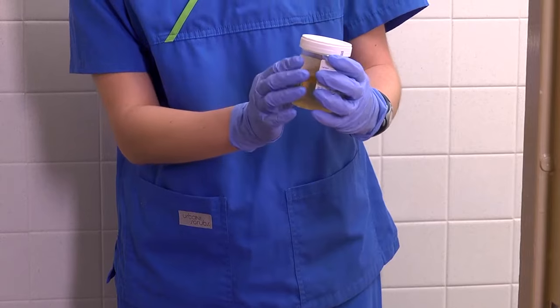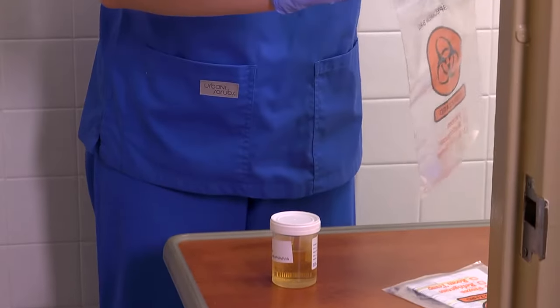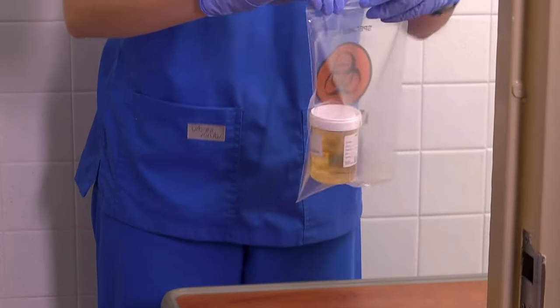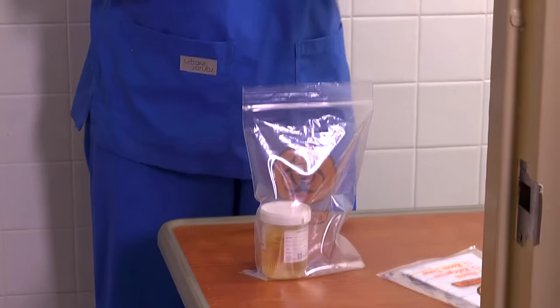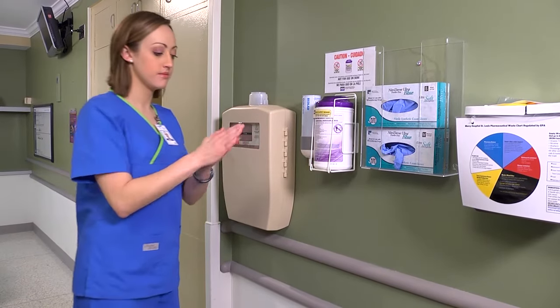Place the specimen in a biohazard bag and send it to the laboratory within 20 minutes, accompanied by a completed requisition form, making sure the time and date are present. Refrigerate the specimen if a delay is unavoidable. Be sure to dispose of all used supplies and perform hand hygiene.